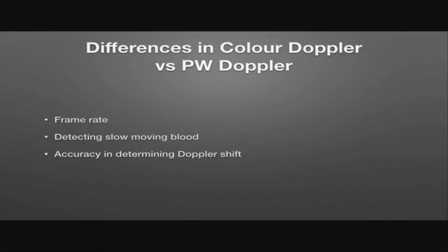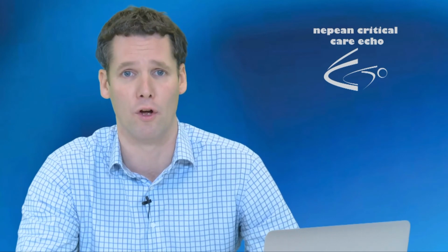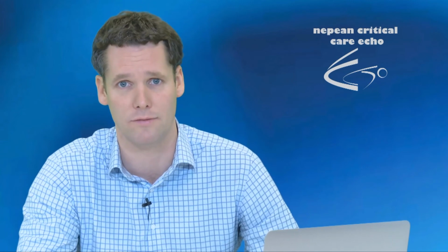Okay. So what are the differences between color Doppler and pulse wave Doppler? Well, you're going to be getting lower frame rates. It's not going to be as good at being able to detect slow-moving blood, because it is less accurate in determining Doppler shift. And that's all because of this autocorrelation, where you're getting this averaging over a specific gate. So if you're looking for accurate estimation of blood flow, particularly slow-moving blood flow, and you want to get the maximum frame rate, you must use pulse wave Doppler. But color Doppler is very important because it gives us an idea visually of blood flow and potentially chaotic movement if you're using variance.